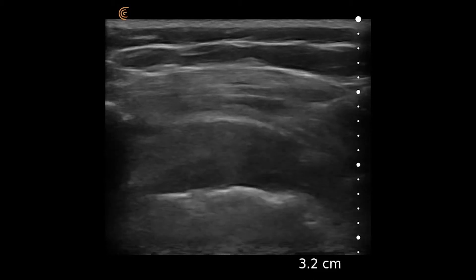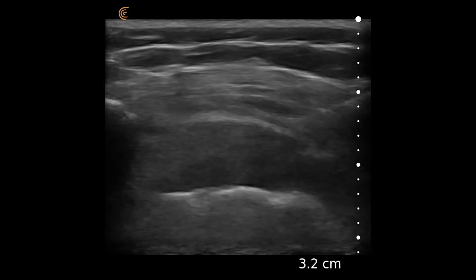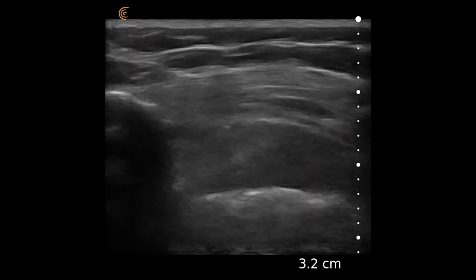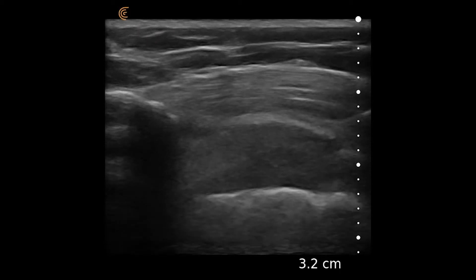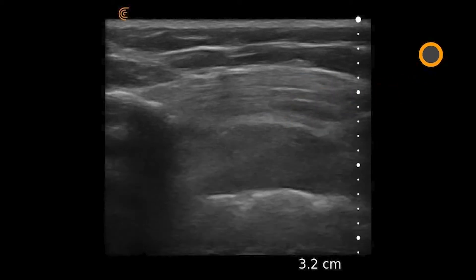The linear scanner on a musculoskeletal preset is placed over the right shoulder with the arm extended backwards. Here's the acromion and the humeral head. There is a thickened, hypoechoic appearance, consistent with what appears to be a chronic rotator cuff injury. Here's the deltoid muscle.